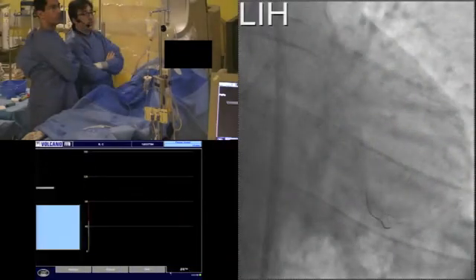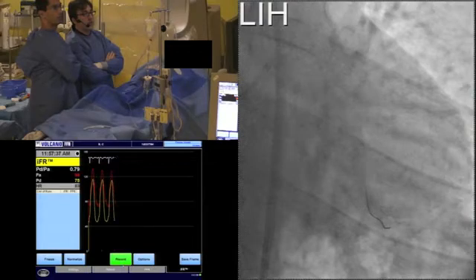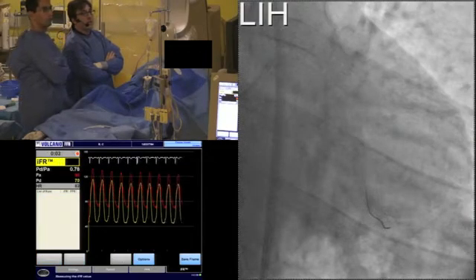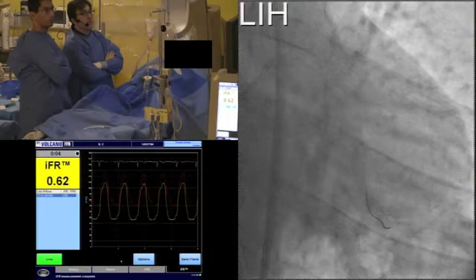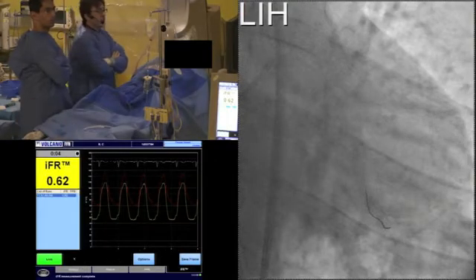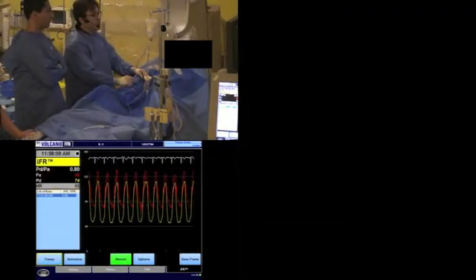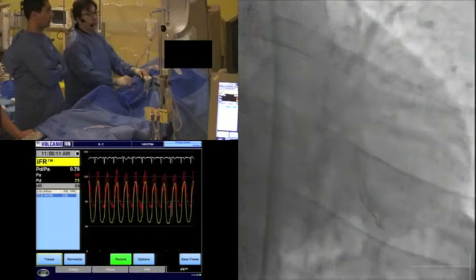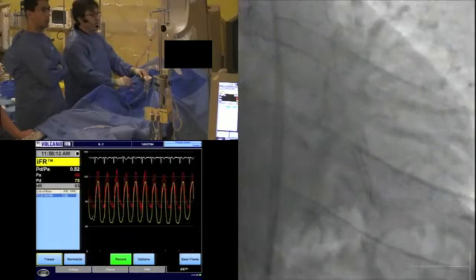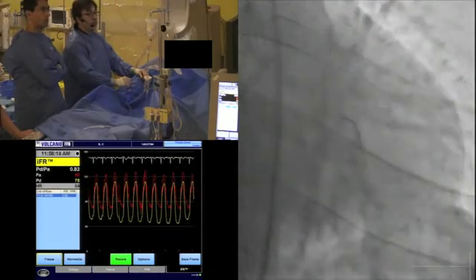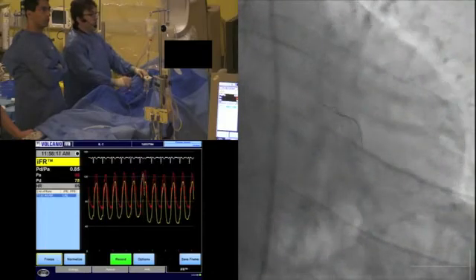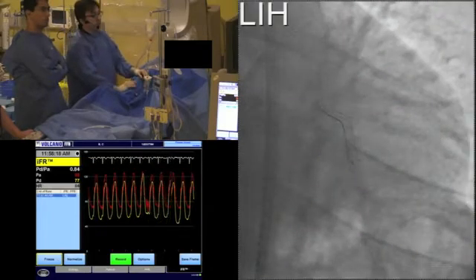So measure IFR there. 0.62—very, very significant. That's fantastic, Kevin. Thank you. I'm just going to pull the wire back now and look to see if there's any big step-ups in the gradient. Nothing really very much here. Maybe a little bit there. So I'm mid-vessel there now.